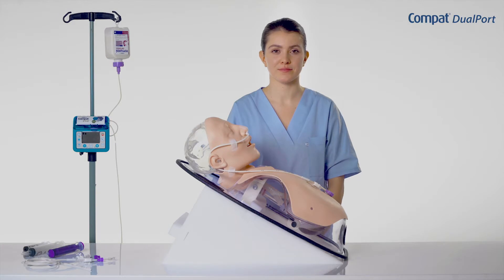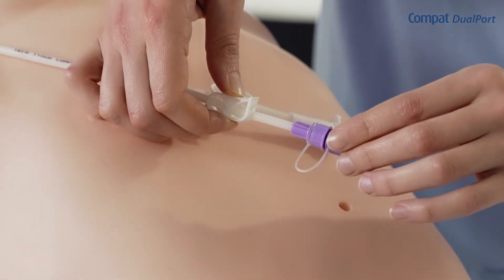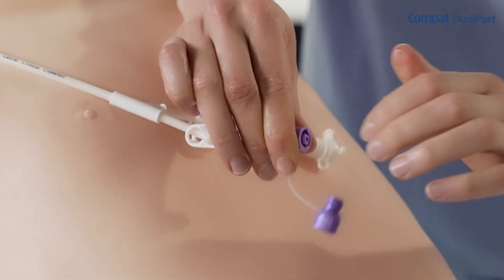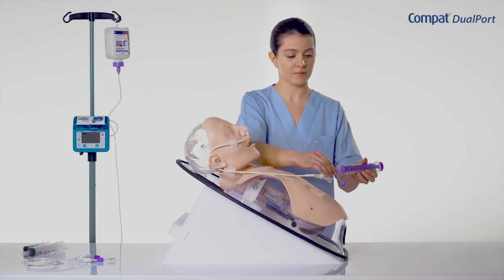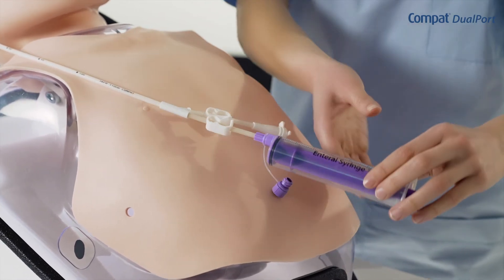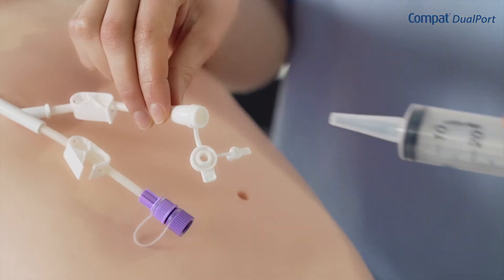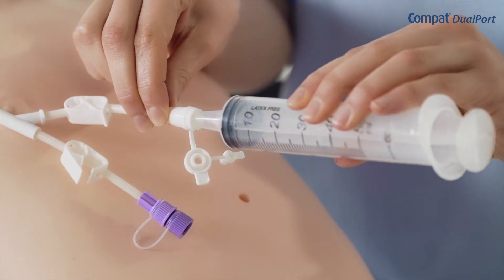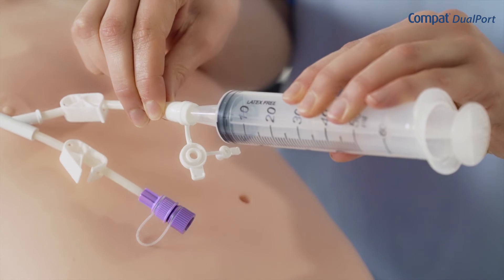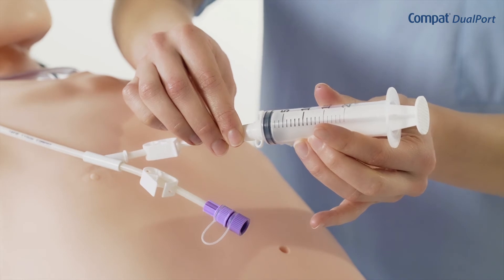Gastric residuals can also be aspirated with a syringe. Use either the enteral feeding lumen or drainage lumen according to the current protocol in your institution. To use the enteral feeding lumen, close the clamp on the feeding lumen and open the cap on the Enfit port. Connect the Enfit syringe, open the clamp, and aspirate the gastric residuals. Syringes with a catheter tip of 60 ml or more connect to the drainage port. Syringes with a smaller catheter tip and oral syringes connect to the port integrated into the cap of the drainage connector.